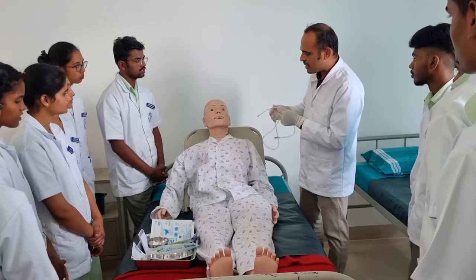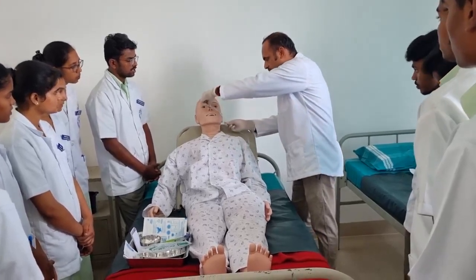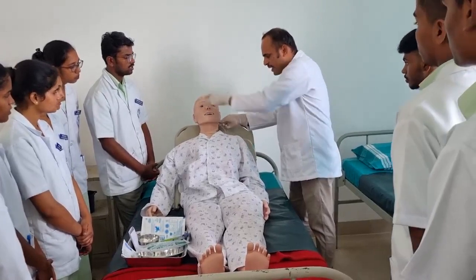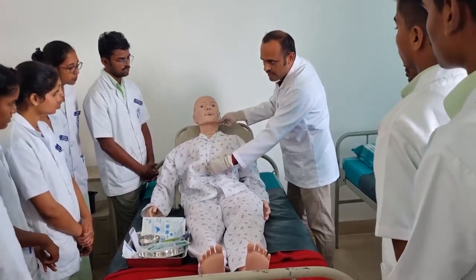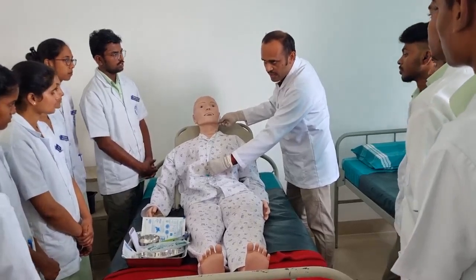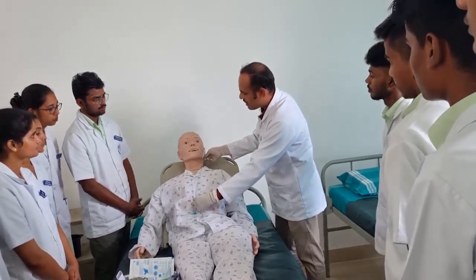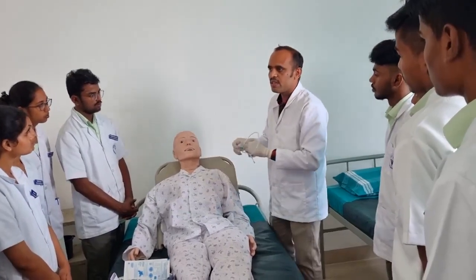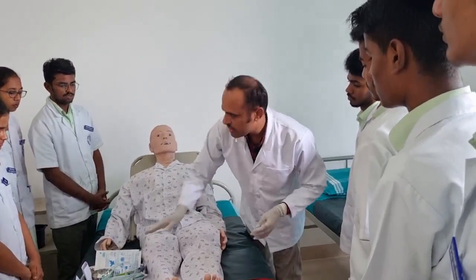So how will you measure this one? From the bridge of the nose to the earlobe, from the earlobe to the xiphisternum. That is the end process of the sternum, which we call the xiphisternum. Okay, that is the method of measuring the NG tube before inserting into the stomach.